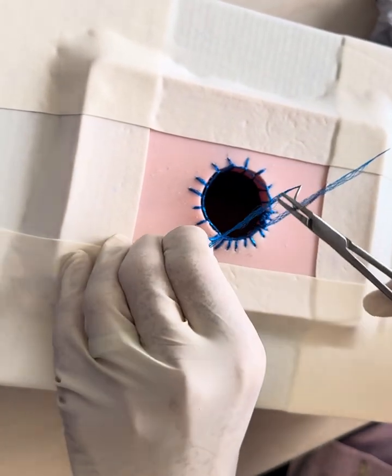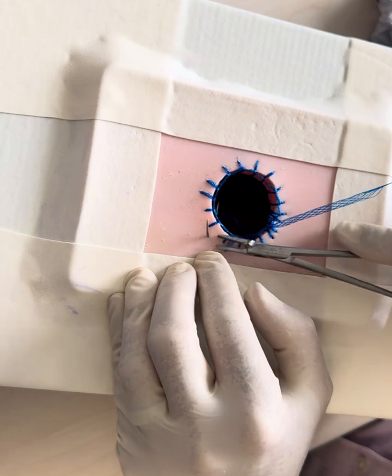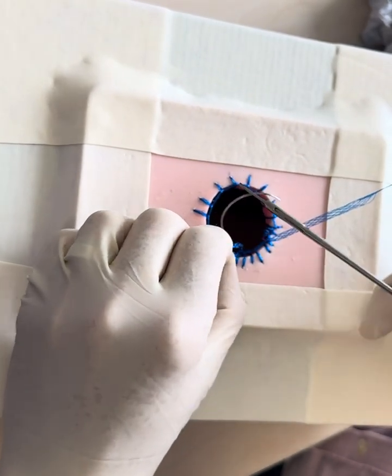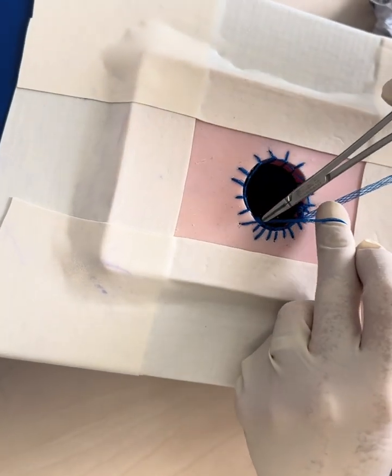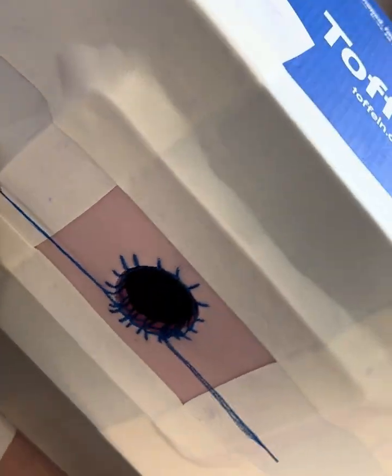So you can adjust the depth that you take to take up more tissue to concertina it in, and the tissues around a parastomal hernia tend to be quite attenuated and weak, but you don't have to take big bites of tissue, you can take relatively small bites. And then once you get to a point such as this, position to take, and then start another Duramesh, just tie it off here and carry on round, and then keep on progressing.